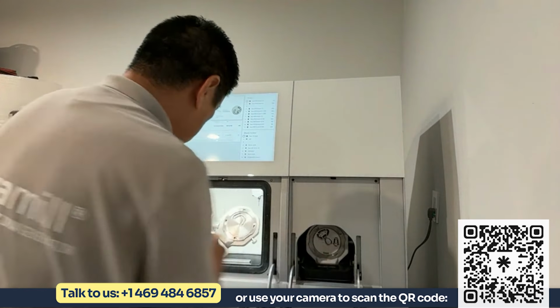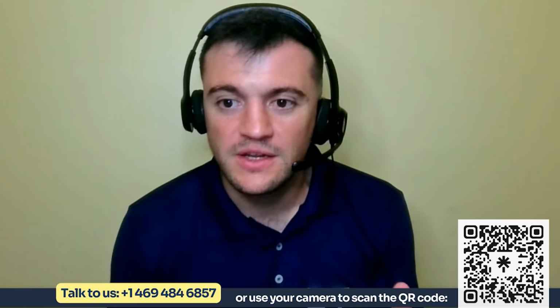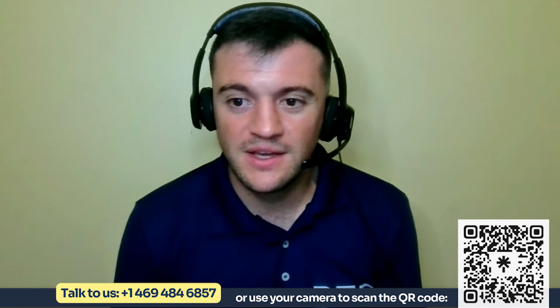We do offer that. And one thing that I'd like to point out, especially when you go for metal milling machines, right? There, of course, are a bunch of other options in the market right now. But when you start to really play with it, mess with it, operate it, you're going to see that they are more industrial-like mills. So they are more complex on the handling side. And as you can see there on the Matron, this is something that I've said for a really long time. It was designed for labs from the beginning. So from labs or doctors from the beginning.